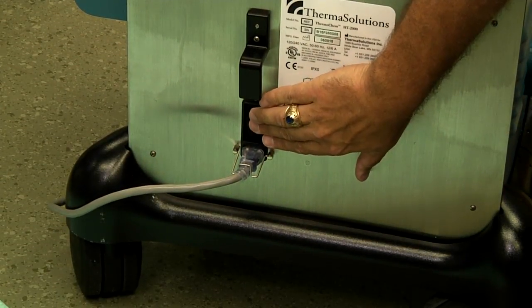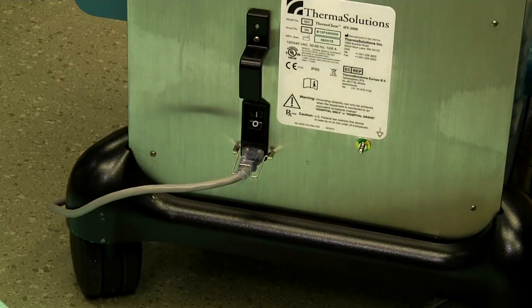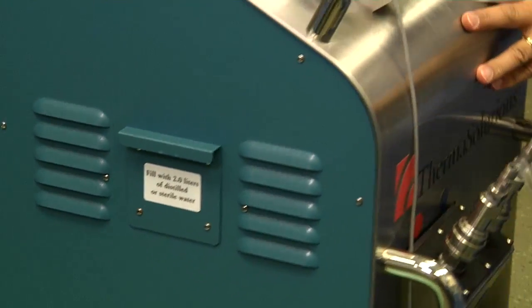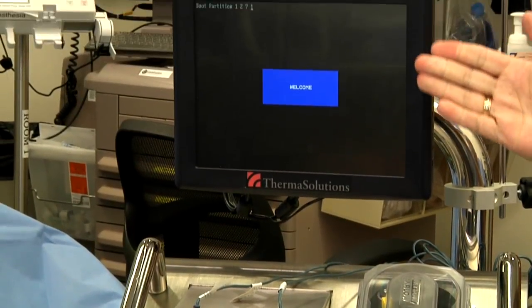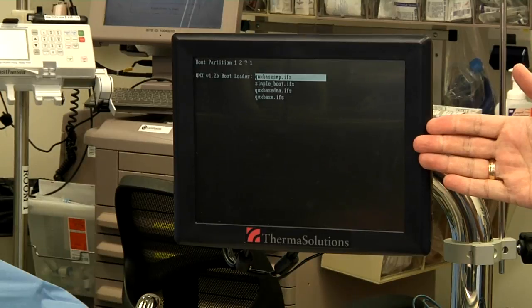We'll power on the device by turning on the power switch on the back of the device. The HT2000 will now go through a boot-up process which takes approximately one minute.